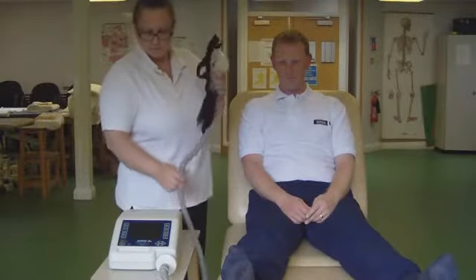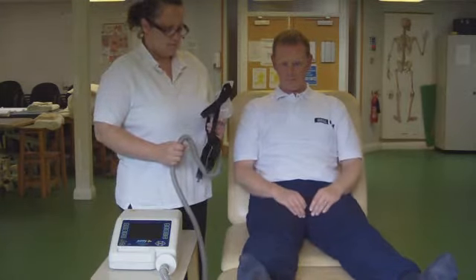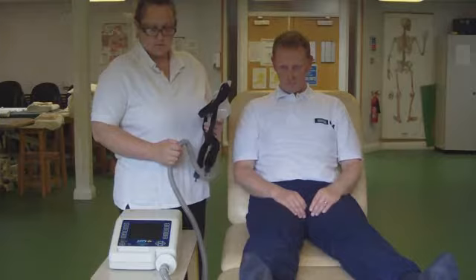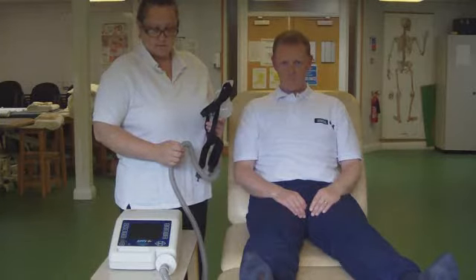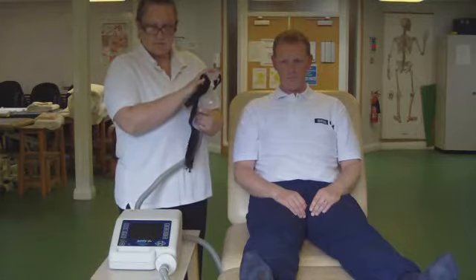We're now going to look at the application of non-invasive ventilation, i.e. positive pressure ventilation without the use of an endotracheal tube or a tracheostomy, via either a face mask or a nasal mask to a patient.